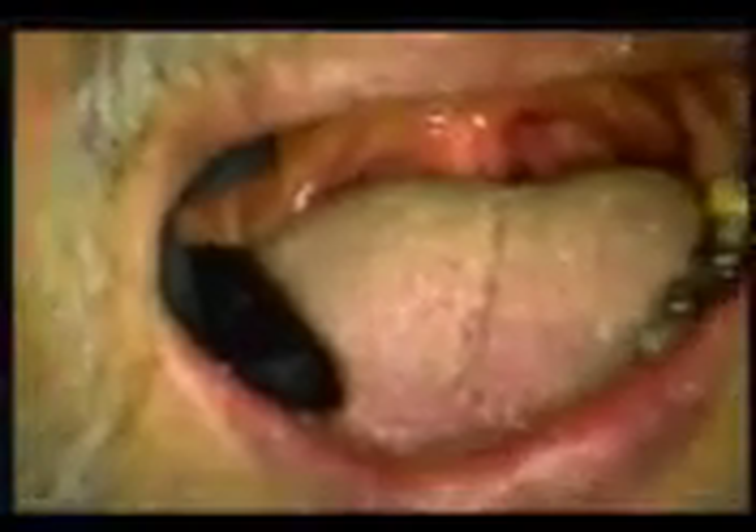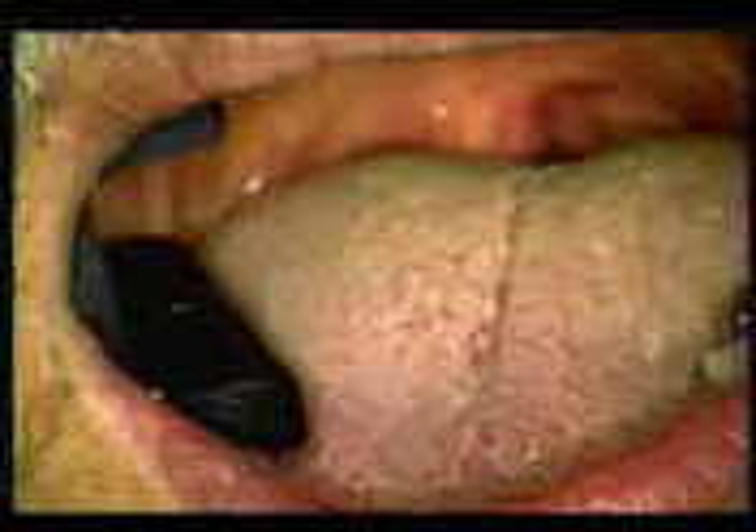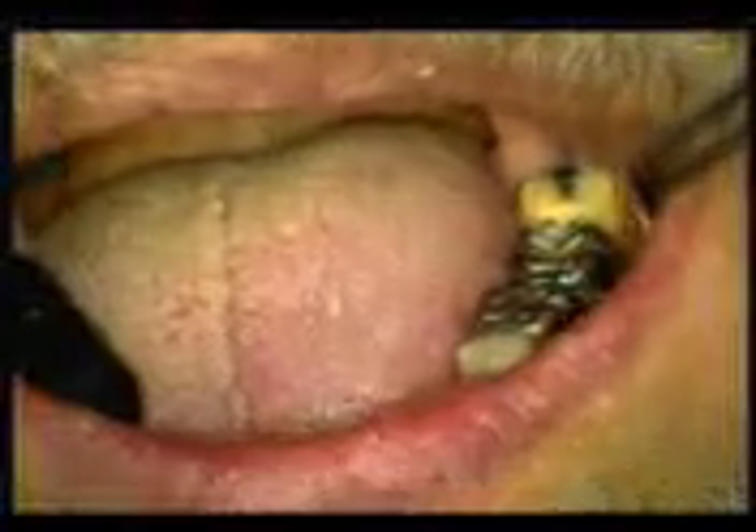We've got him anesthetized and we're going to go through there. This tooth doesn't look like any big deal, but as I state, it's fraught with danger. We're getting everything set up here on the video — and a nice little hairy tongue there. You'll note that 18 and 19 have old metal crowns on them.